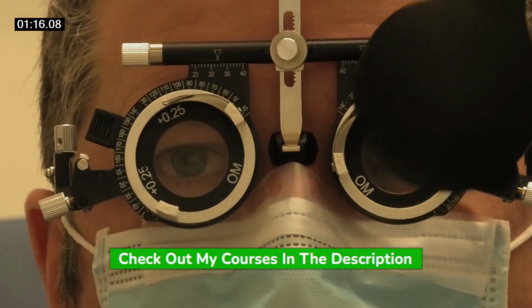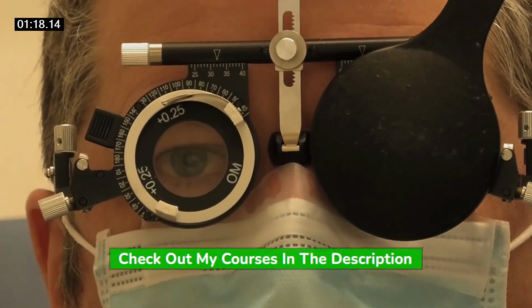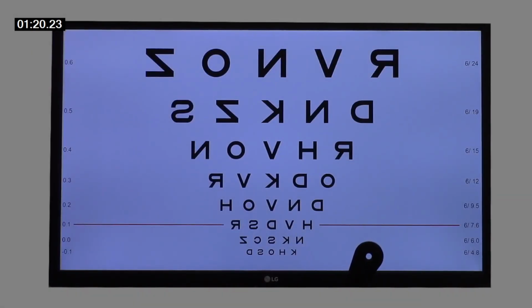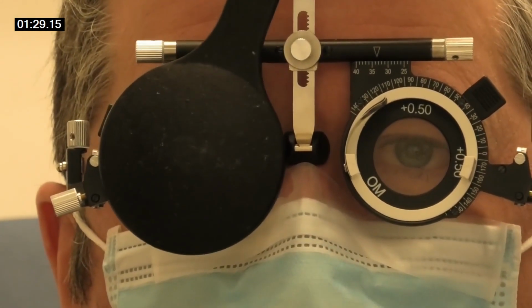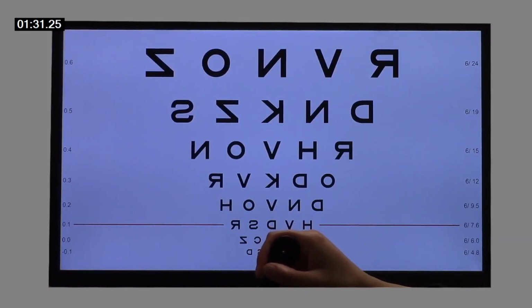So I'm just going to cover your left eye. What is the smallest line that you can see there? So it's the bottom line. Bottom line, you just read it out. That's KHOSD. Yep. And what about now? It's the same again, yeah, the bottom line. Okay.